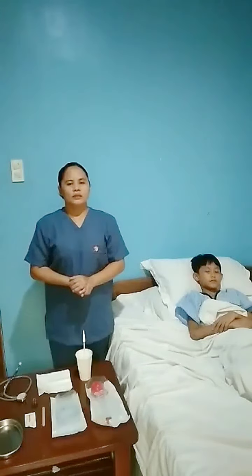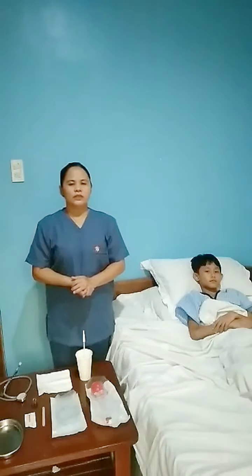Good day everyone! My name is Rangas, a caregiving student from St. Augustine School of Nursing, Iloilo. And today, I'm going to demonstrate to you how to insert a nasogastric tube, feeding and removal of NGT tube.